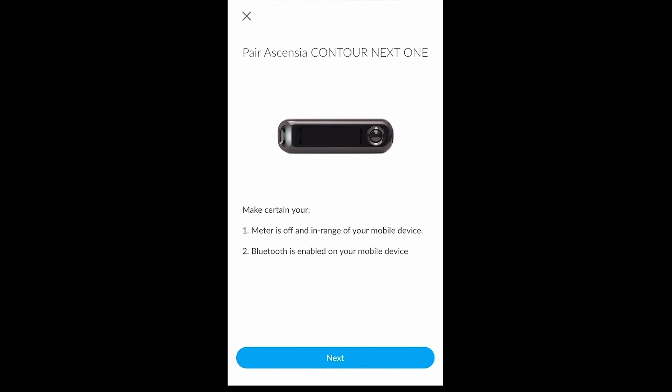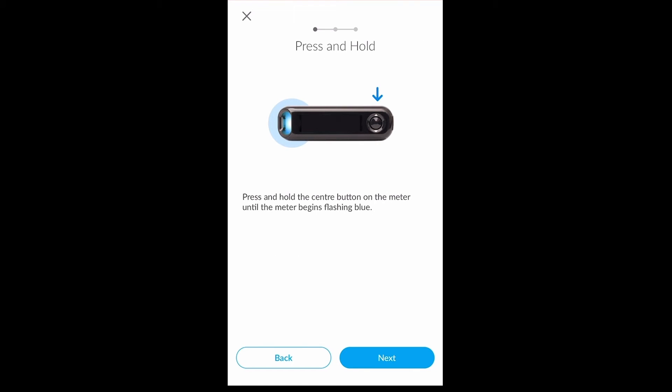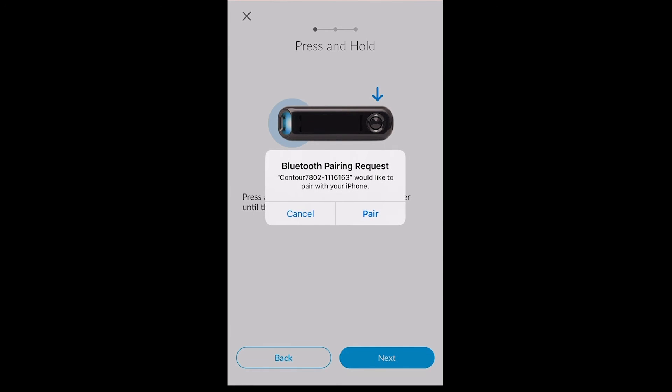Once you have followed the on-screen instructions, please click Next. You will find that the app will pair directly with the device in question — as you can see here, I am pairing a Bluetooth device. You may be prompted on screen to pair the device with your smartphone; if so, click Pair.